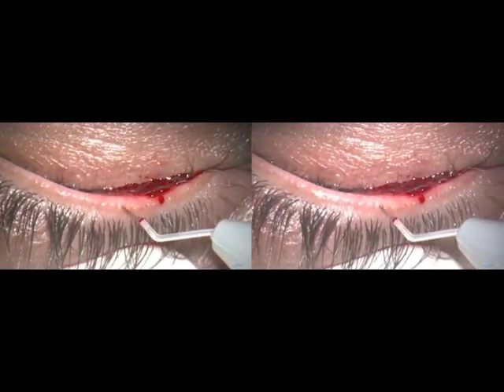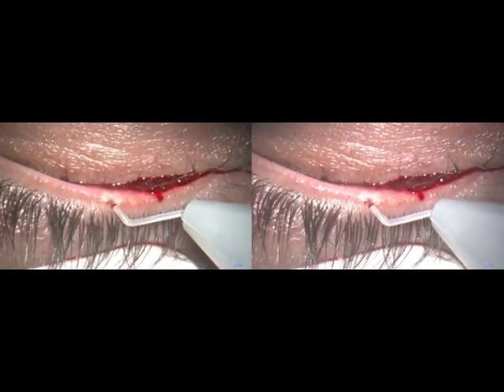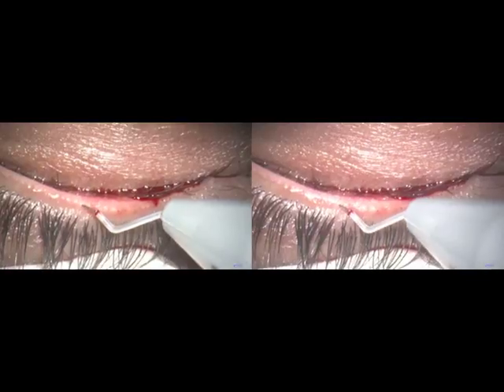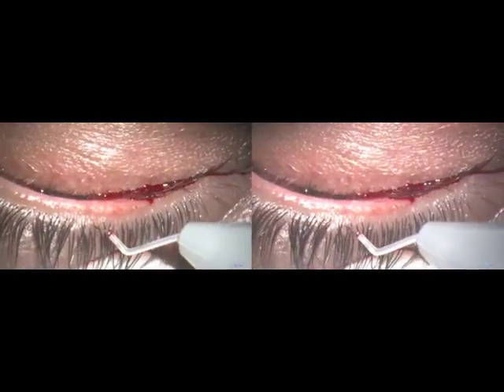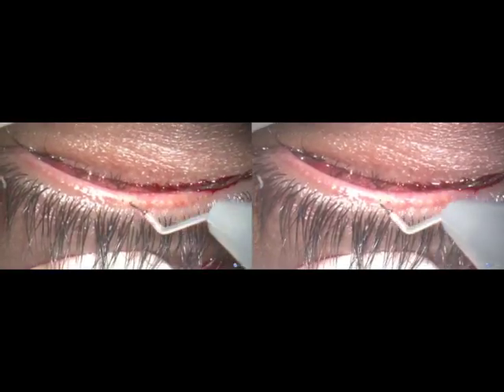One after the other we go into each meibomian duct, which gets cleared. You have to be very careful that you are in the lid and not going through the lid into the eye. It will never happen — I have done many cases and it shall not happen — but this is a warning.